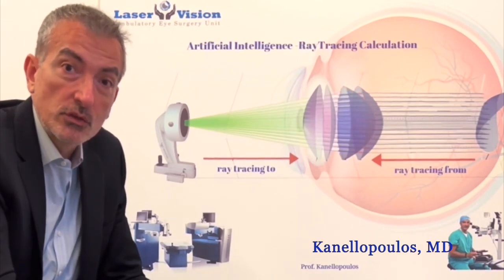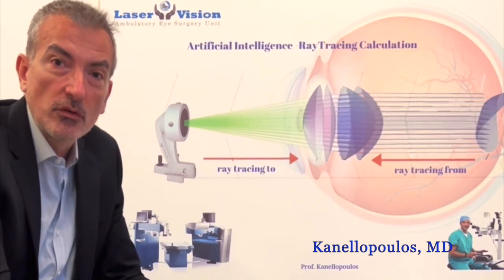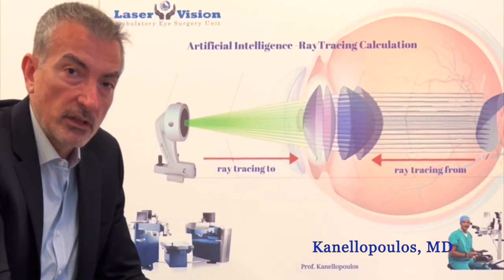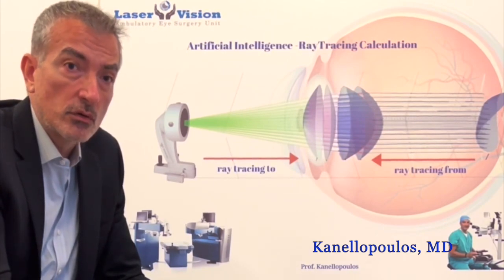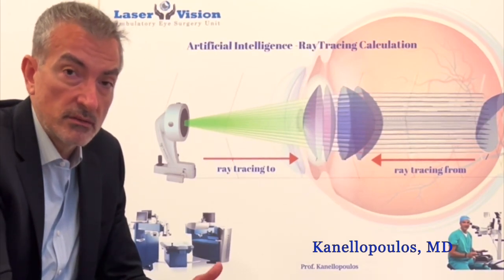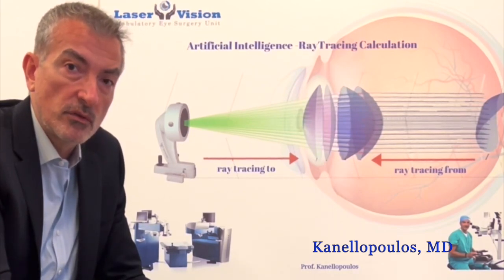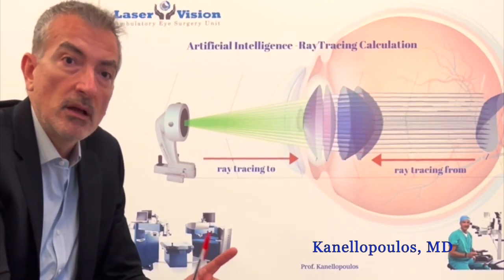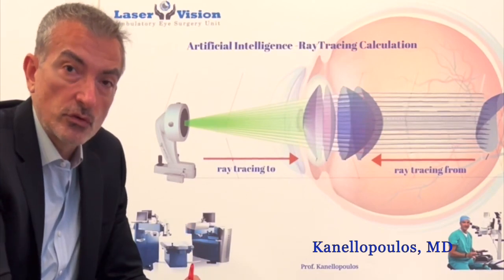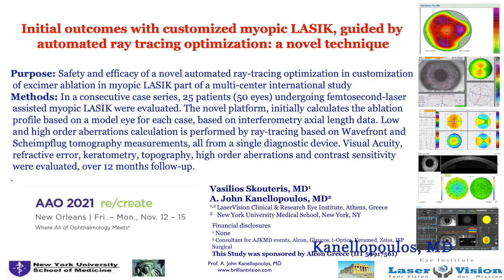So we're going to look into some data from our clinical work with the fascinating ray tracing software and how this resonates its ability to not only effectively correct refractive errors, but also obtain better contrast sensitivity than before the surgery. This is very impressive, and also gain of one line of vision in more than 65% of the patients when we compare best corrected vision prior to the surgery and uncorrected vision after the surgery. So let's look at the clinical results from meetings of the recent past.